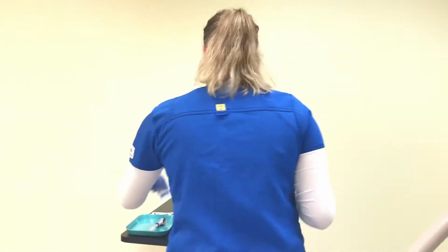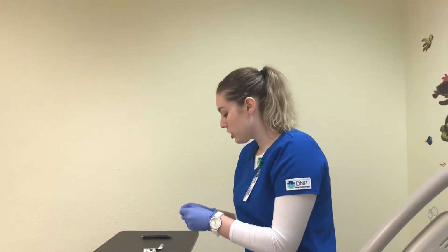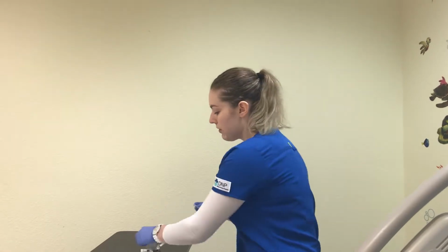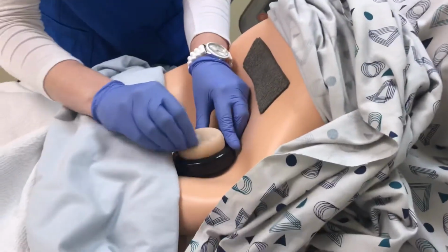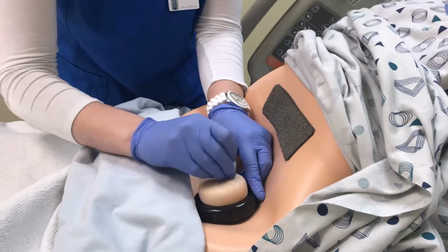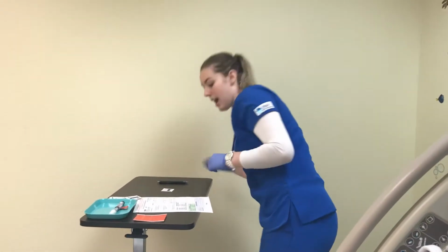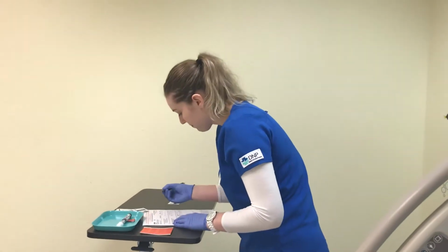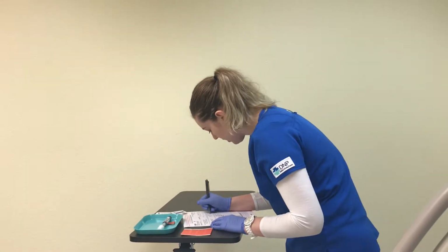Okay, so Shirley, I have your second injection, which is your pen, and I'm just going to move injection sites to the other side of your abdomen. So I'm just going to clean it off again, and now I'm on the other side of your abdomen. Okay, and as that dries, I'm just going to mark down that I have given her first insulin injection.